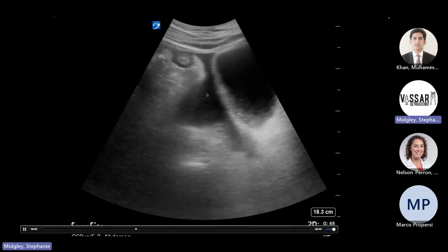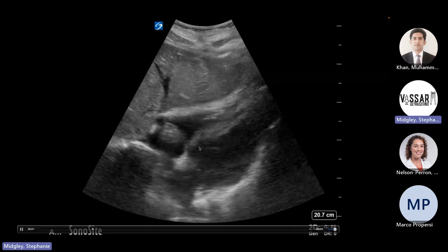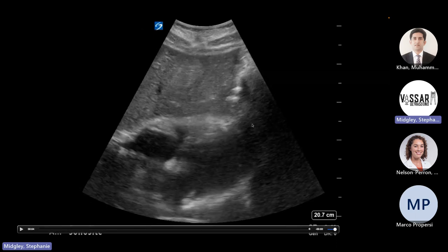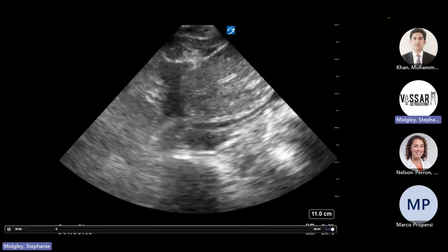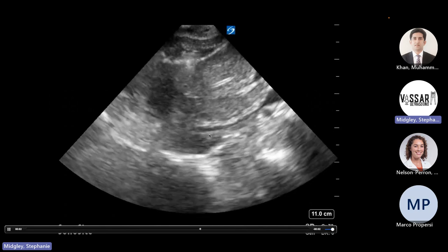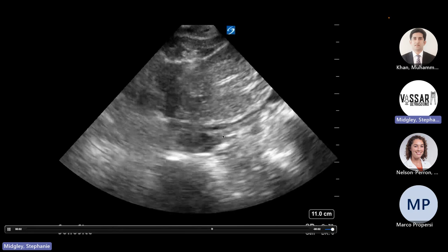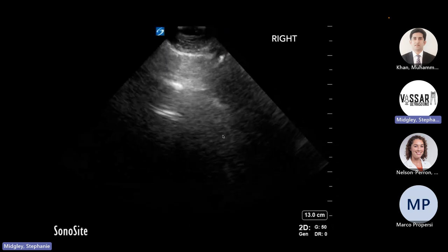And we come down to the bladder, right? More positive FAST. And then we look at our heart, our squeeze is good. There's no pericardial effusion. And her IVC is kissing. So all of this is going to go to some sort of hemorrhagic shock appearance, right? We're hypotensive, our volume's down. So our IVC, our CVP pressure is really low. And we've got free fluid in our belly.